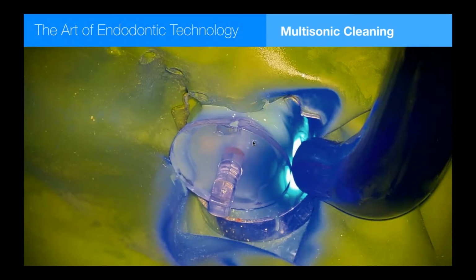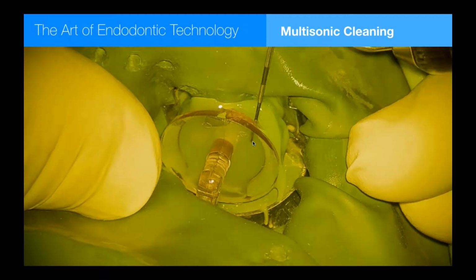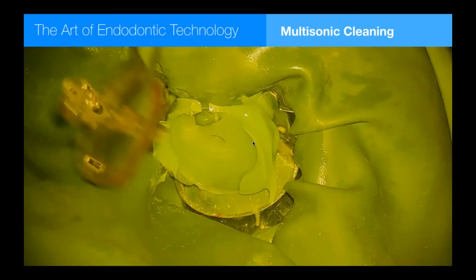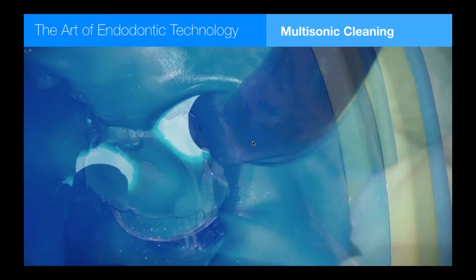Then I use an Explorer as taught to me by my trainer. Very carefully tip this off. I want to make sure that seal stays intact on the occlusal surface. And at this point, I'm going to go ahead and do light curing again to make sure it's as stable as possible.